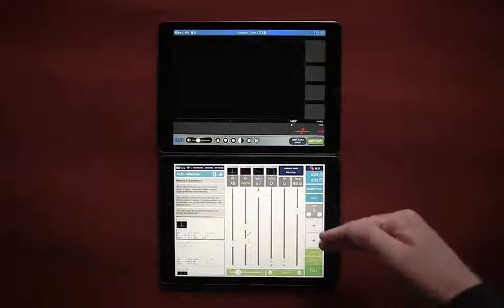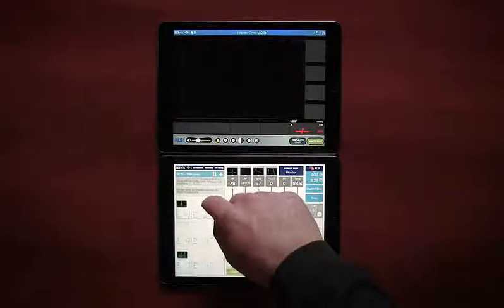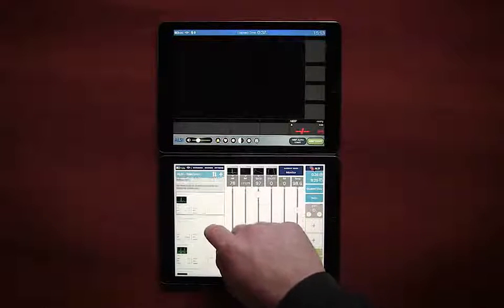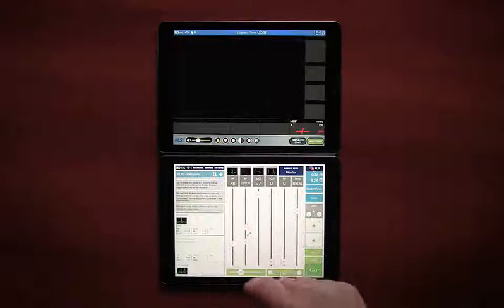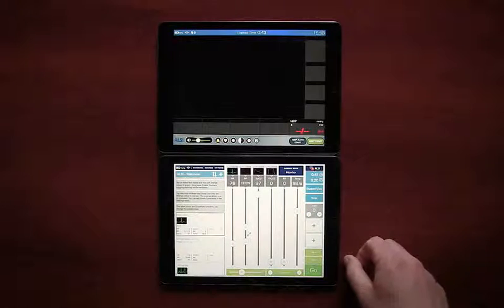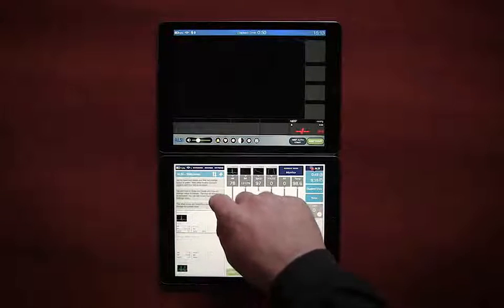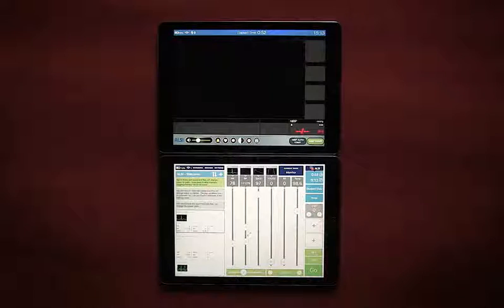And on our instructor iPad, which is this one here, you can see the screen is broken into two sections. On this side we have the custom scenario that we've built, where we're going to make changes by advancing through the boxes, and on this side we have our manual changes that we can make by utilizing the slider bars or grabbing some different rhythms. So if we come back on this side, these gray boxes are where you as the instructor can deliver your teaching points, so we can build them in.